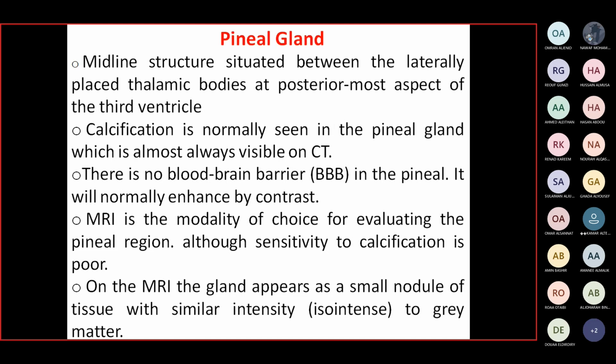The other gland is the pineal gland, which is a midline structure situated between the two thalami and posterior to the third ventricle. The most important thing to know is that it is a midline structure. This is the normal position of the pineal gland, midline between the two thalamic bodies and posterior to the third ventricle.